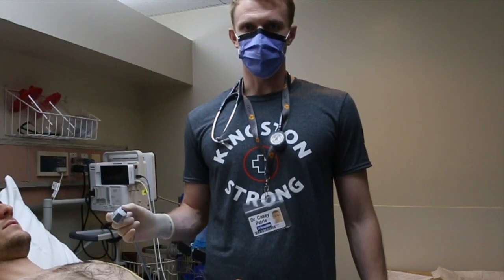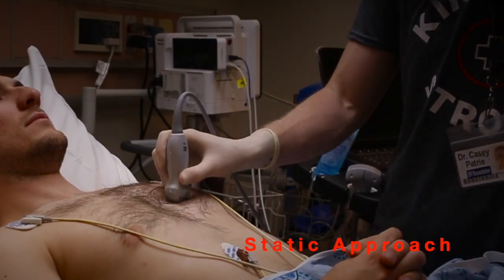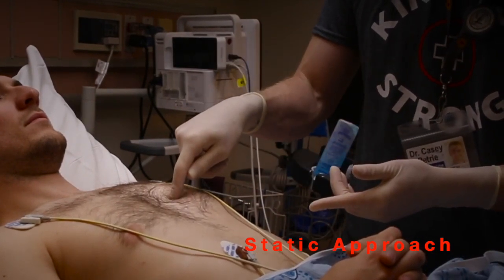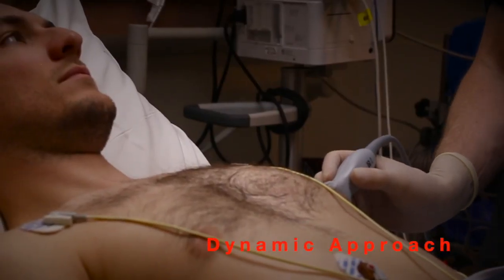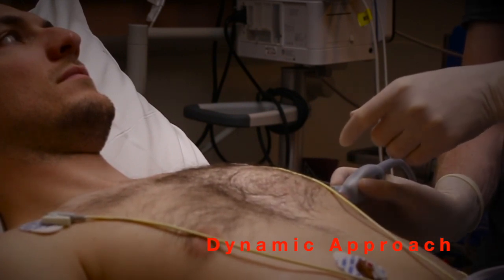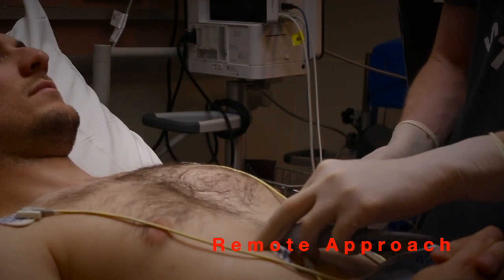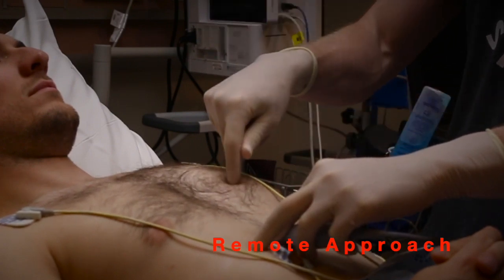There are three approaches to using an ultrasound to guide your pericardiocentesis. The first is a static approach, where you landmark with the ultrasound, put it down, and then use the trajectory you've already determined to advance your needle. The second is the dynamic approach — similar to a central line — where you use the ultrasound to watch the needle penetrate the pericardial effusion. The third is the remote approach, where you simply use the ultrasound to observe the pericardial effusion shrinking while you drain it.